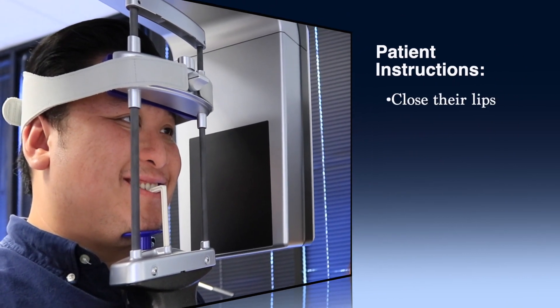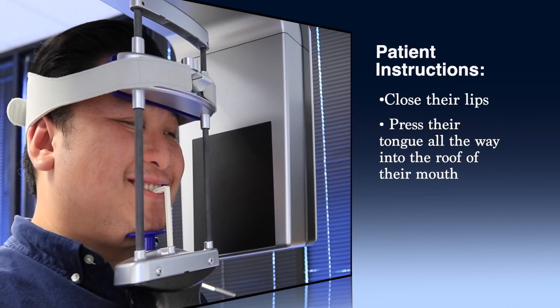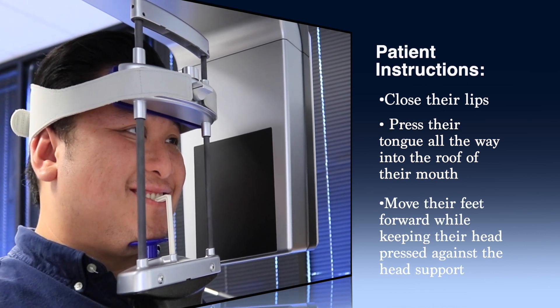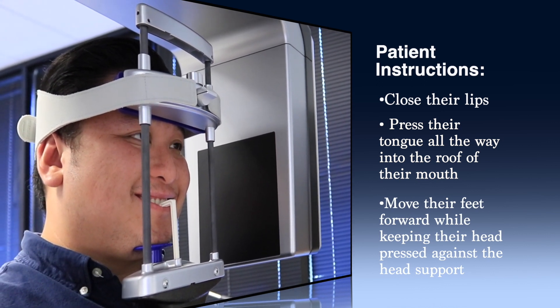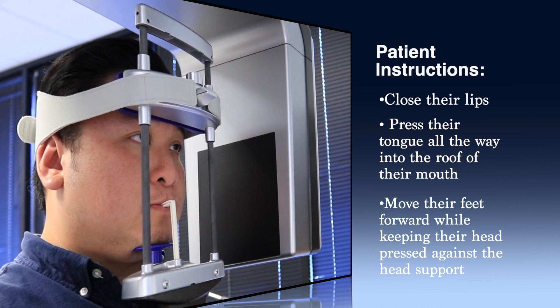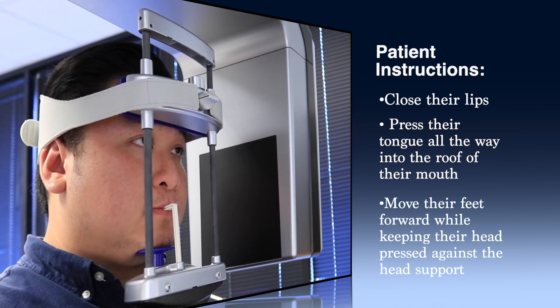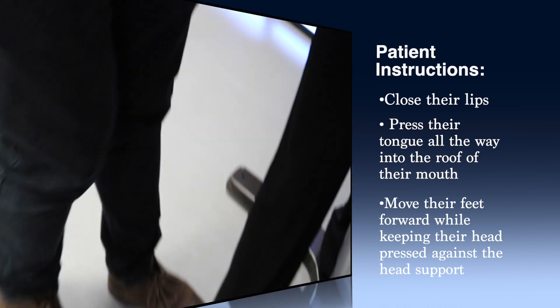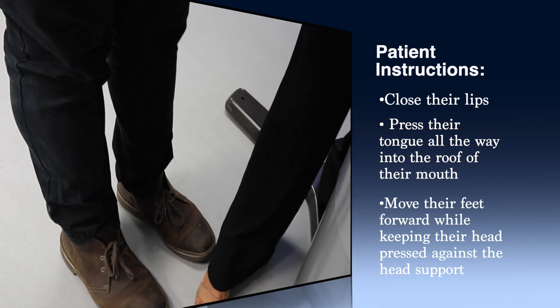The patient instructions will be to close their lips and to have the patient press their entire tongue to the roof of their mouth, to avoid the dark shadow that is sometimes seen in the upper portion of some panoramic images. You will also ask the patient to move their feet forward a few inches while they keep their head pressed against the forehead support.